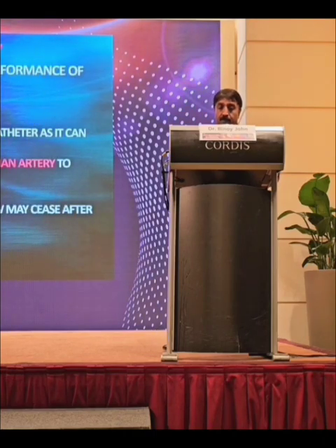So coming to the intervention, knowing the IMA characteristics is key in performing a safe PCI. Ostial dissection can occur, and it is important to avoid deep throating of the guiding catheter as it can produce ostial dissection. A second wire can sometimes be passed into the left subclavian to prevent deep throating of the guiding catheter. And the IMA is highly prone to spasm, and flow may cease after wiring, producing no flow, ischemia, and infarction.